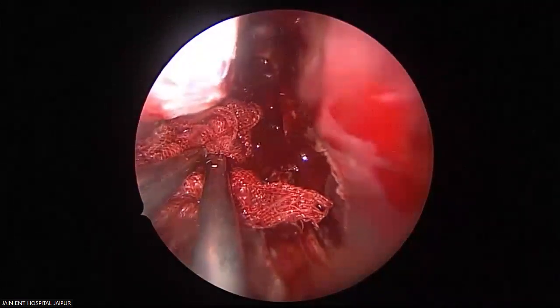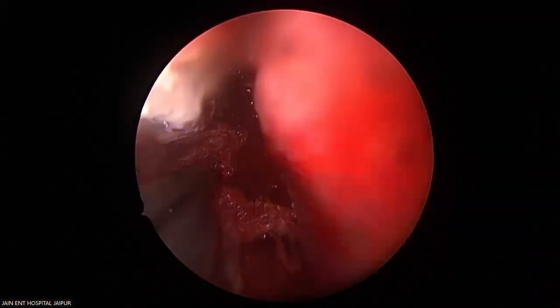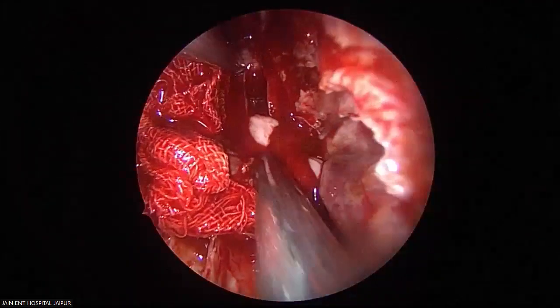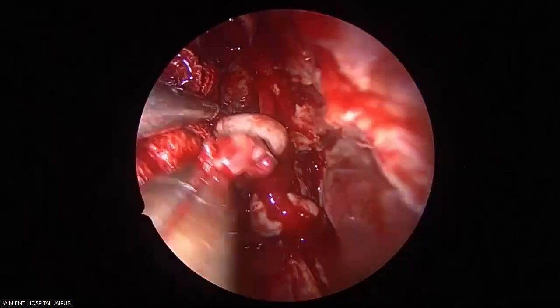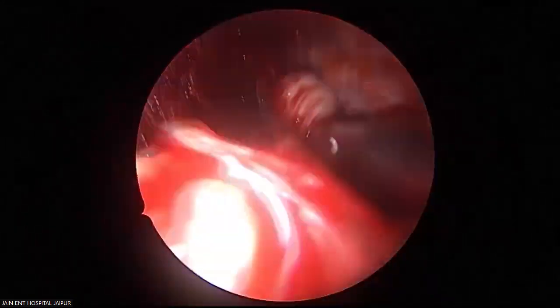I'll take suction on the other end. Now see where the tumor has come. Some more parts are there. I will show you. See, tumor is here in the nasopharynx. See the huge tumor. Entire lateral component has been pushed into the nasopharynx.